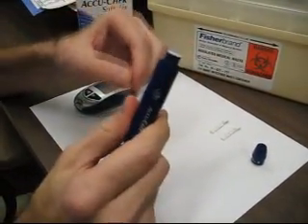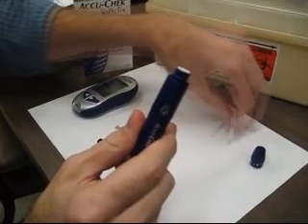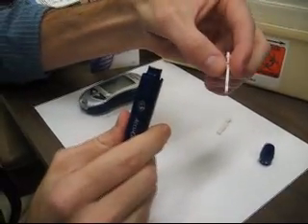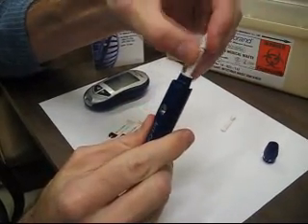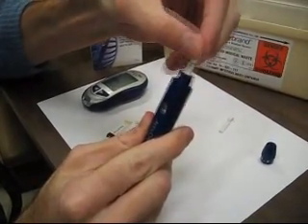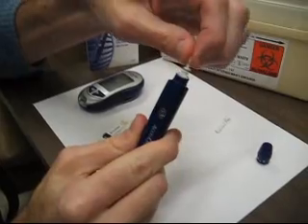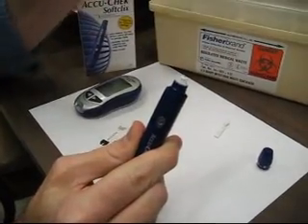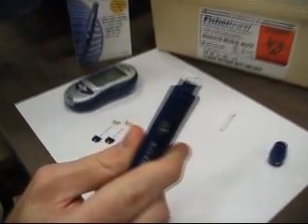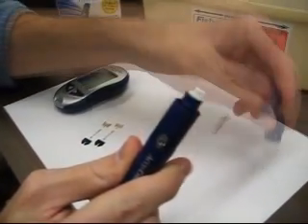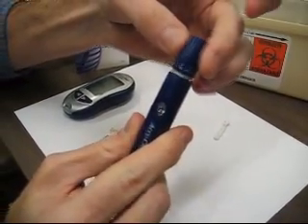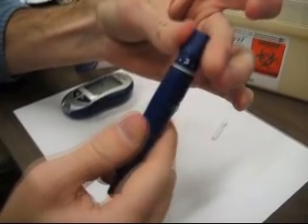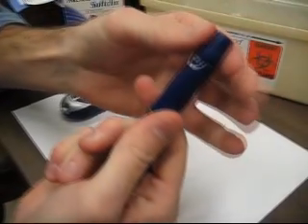Load the empty lancet device with a new disposable lancet. Push it in until it clicks and then twist the cap off. Place the lancet device cap back on until it clicks.